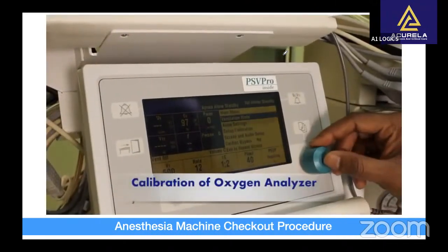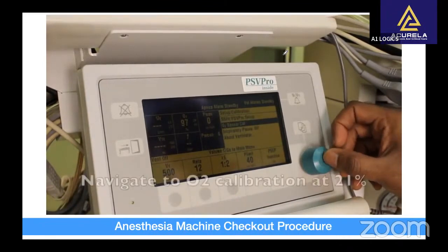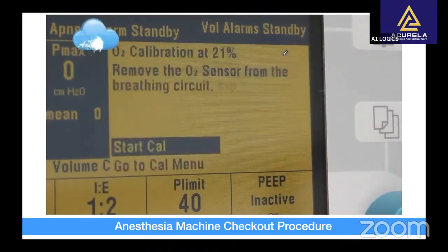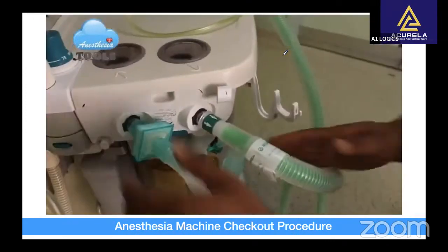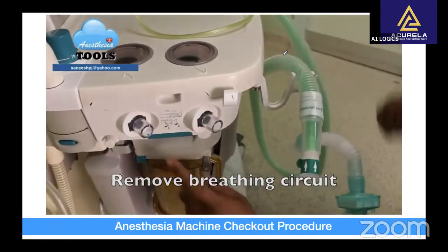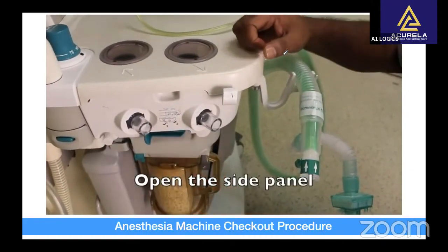Next step is to calibrate oxygen sensor. Navigate using menu bar to oxygen calibration at 21%. Remove the breathing circuit. Open the panel as per the manufacturer's instructions.